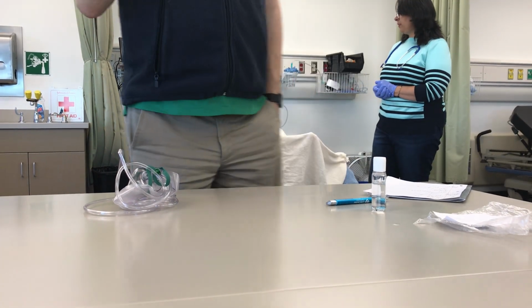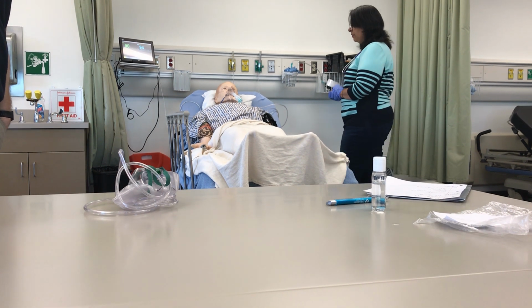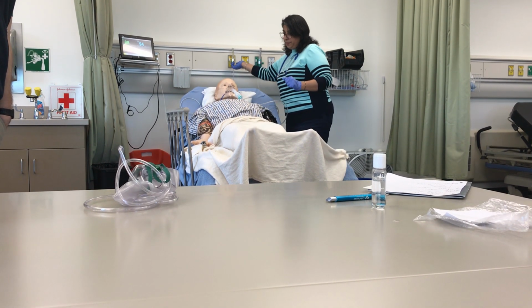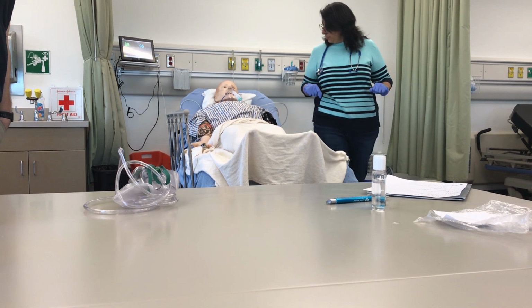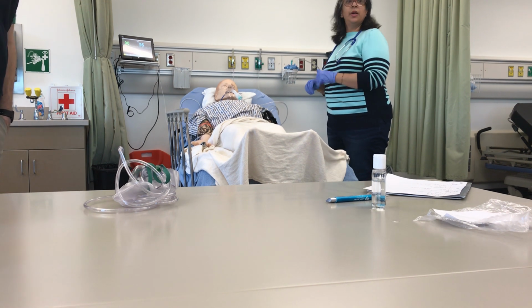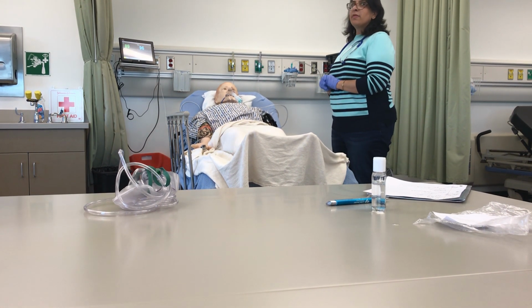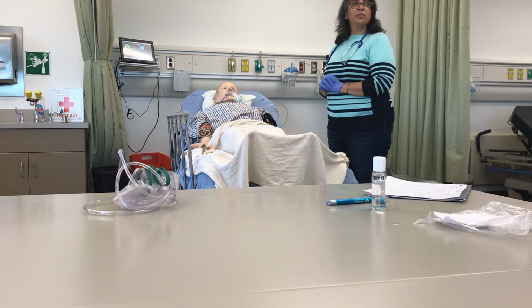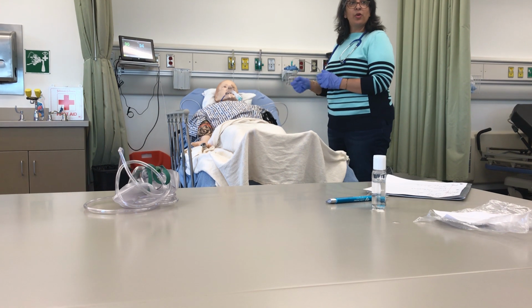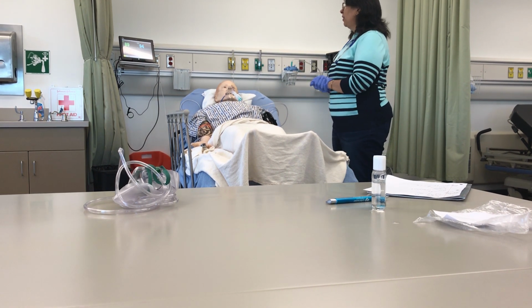And then I try to be kind of secretive about it. What if, when you find that position where you're noticing the chest rise, you essentially watch the monitor, you're observing the monitor, like, I'm just gonna check how the stats are rolling for you, and then you can see the chest doing its thing as you're looking at that television. Yeah, that's fine. You can do that, and you can ask them some questions. Some people like to talk, and they're a little chatty if they can tolerate that.